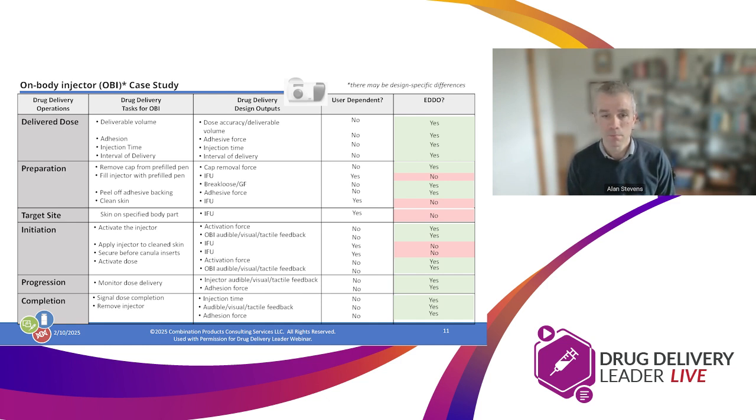And so those are the aspects I think that the agency is really describing here. And that's how we can get into, in this case, cap removal or peeling off the adhesive backing and the adhesion force of the adhesive itself. Those are design elements of the device that are being selected by the manufacturer and not really related to the user's understanding or capability of using the device.